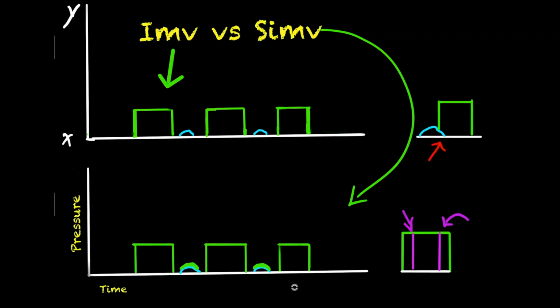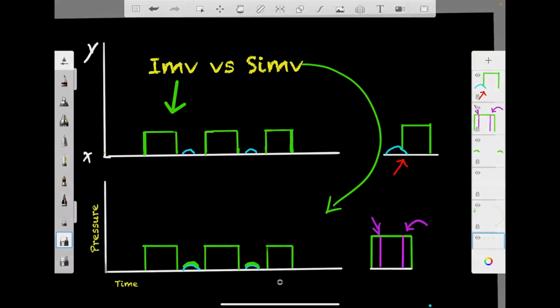And eventually you're going to have a huge lung volume and increased thoracic pressure. You could potentially have a hypotensive crisis on your hands. If they have bad lungs, you could even create a pneumothorax. So IMV is kind of going out of favor. There are much more advanced settings than SIMV, but I personally like it. There you go.